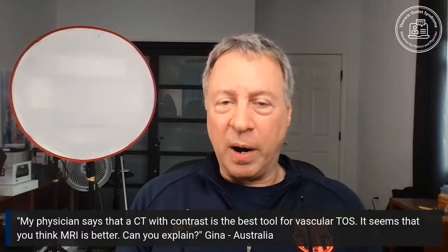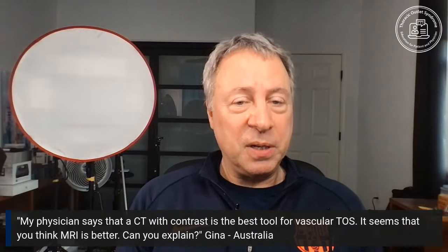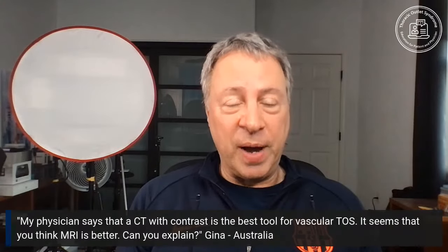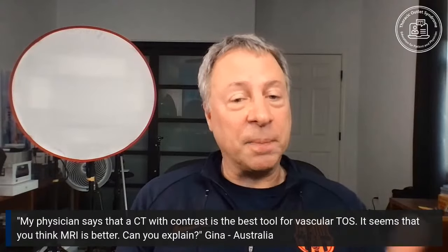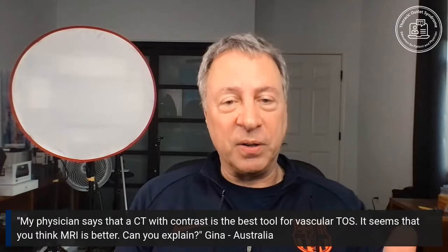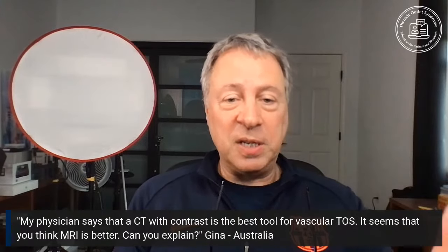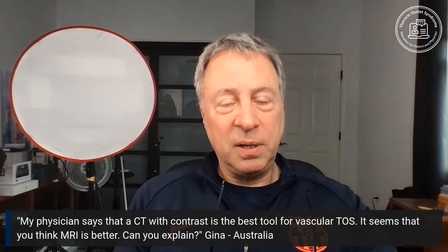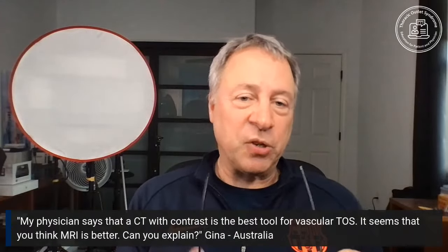When you do an MR, if you look at the blood vessels, you don't see anything else. If you do the best MR angiogram or MR arteriogram, you absolutely won't see anything else. That's the purpose of it. Nothing interferes with your view of the arteries or your view of the veins. Now that means you need to take your eyes off that picture and you look at the other MRI images you got at the same time without the patient moving.